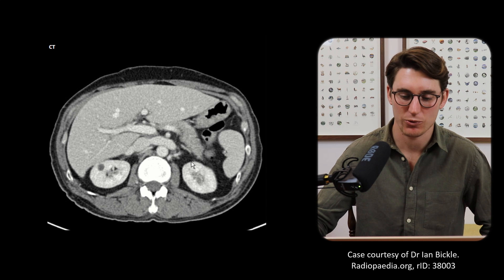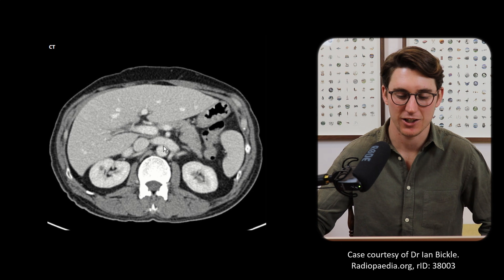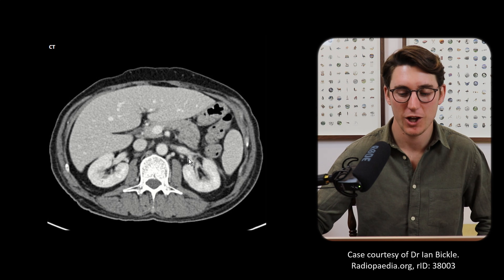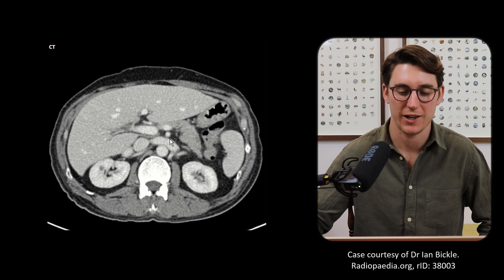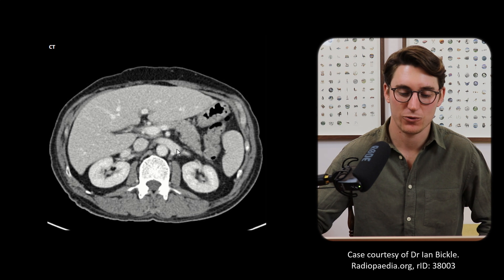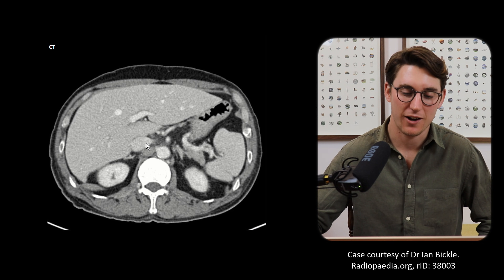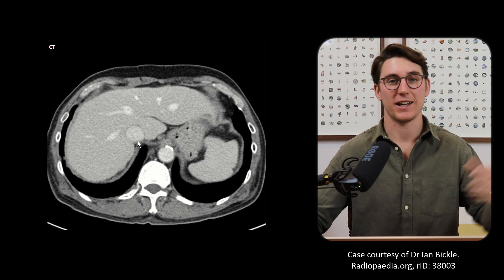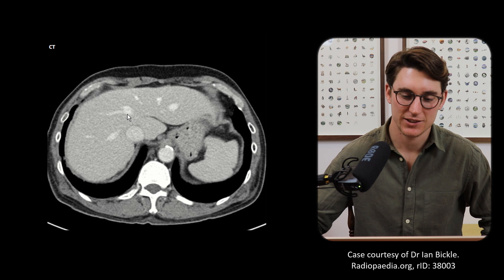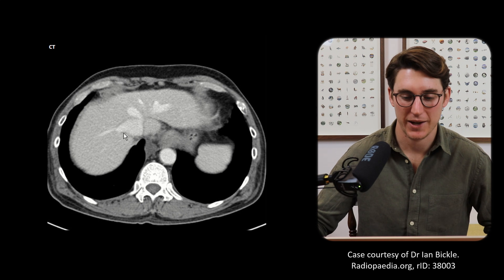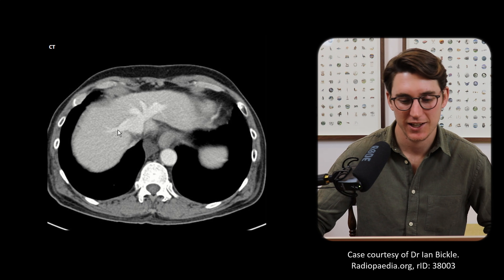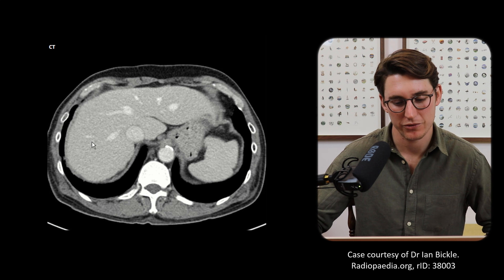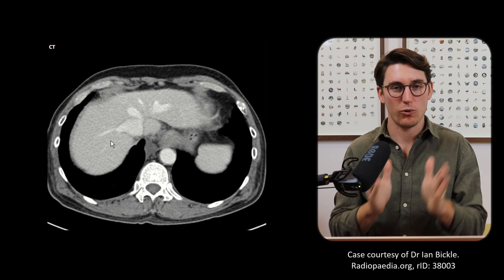One good way of confirming the IVC is we can see our renal veins coming into it. Our left renal vein runs anterior to the aorta and posterior to the SMA — we can see our left renal vein and right renal vein coming into the IVC. As we scroll upwards, we'll see the left, middle, and right hepatic veins coming into the IVC. We're going to use those hepatic veins to draw lines out to the periphery — from the left hepatic vein, middle hepatic vein, and right hepatic vein — to separate the liver into our four different sections.